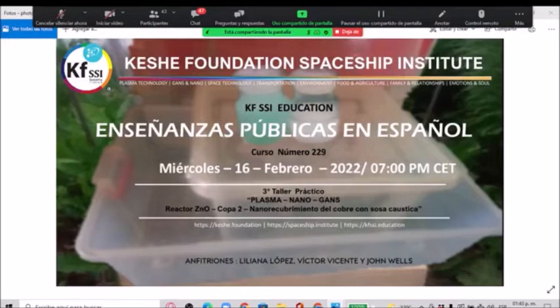Sí, en la técnica dentaria también hemos nanocubierto el cromo, el níquel, platina, metales que se utilizan en la técnica dentaria. Gianni has worked all these dental works with different materials, so he's got experience on the nano coating of all these different materials like platinum, chrome or whatever.